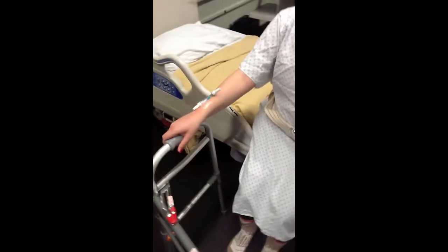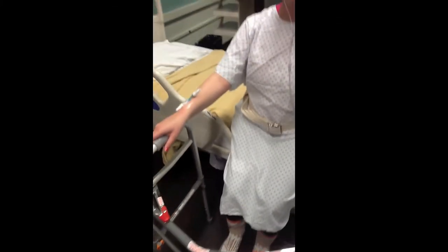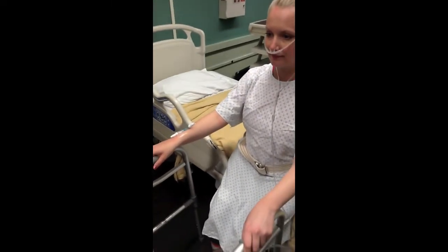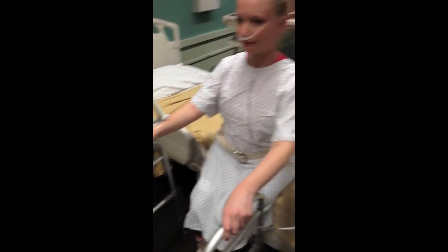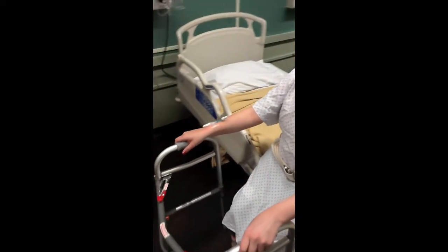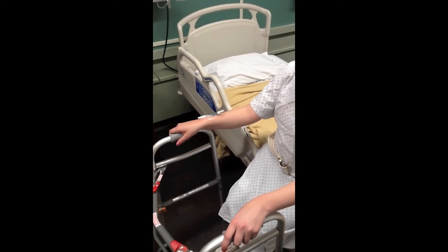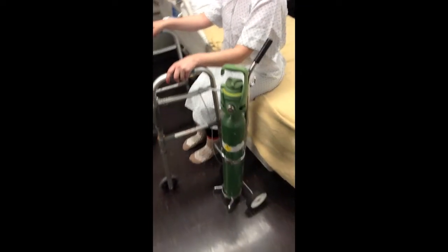A tether check is also very important. Don't forget to check the Foley and make sure that it's not pulling on the patient, because this could cause a lot of pain and discomfort. Ask the nurse how many lines or tethers the patient has to prepare yourself for ambulation. Communicate as a team, and if needed, ask a second nurse or tech to help you with additional tethers such as the O2 tank or follow you with a wheelchair.